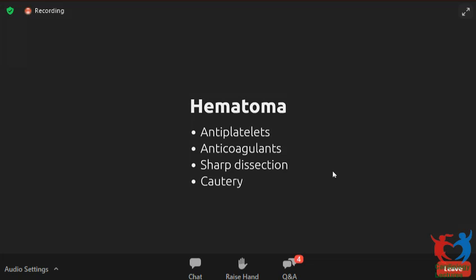Why is there no need for anticoagulants in the RV system as compared to the LV? Because the leads tend to have small clots form on them, but these tend to be very small clots. In the RV, such small clots, even if they go into the pulmonary arterial tree, don't produce any major pulmonary embolism. So you don't really need to put them on anticoagulation.